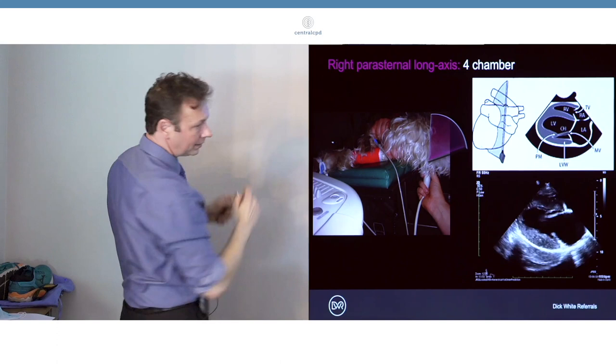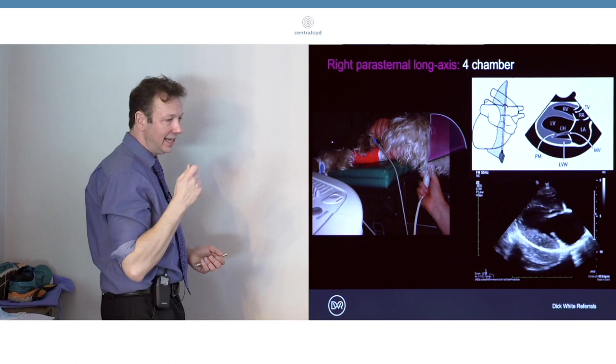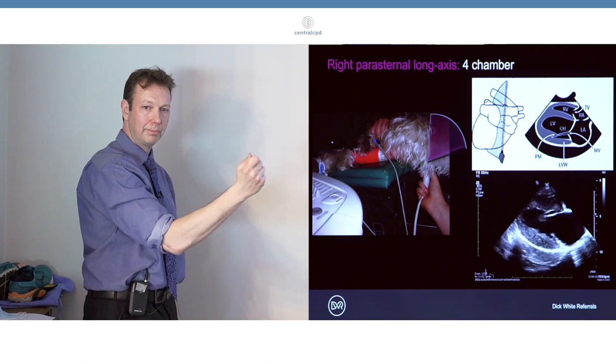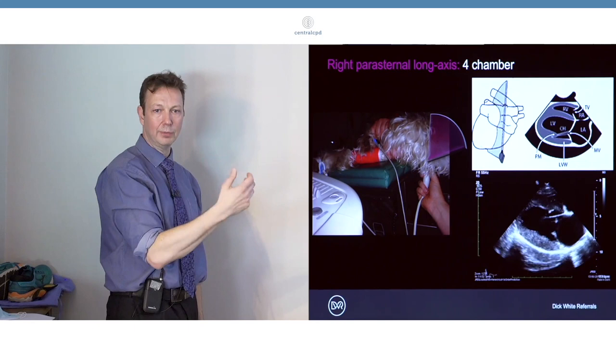Don't be afraid to advance or go back in intercostal space if you're not happy with the position of the heart. Try sliding up in the intercostal space. If that doesn't work try moving one forward. If that doesn't work try moving one back - triangulating. But don't do more than one thing at once when you're doing it. Do those sequentially and you'll soon get an eye for what maneuvers help and what don't.